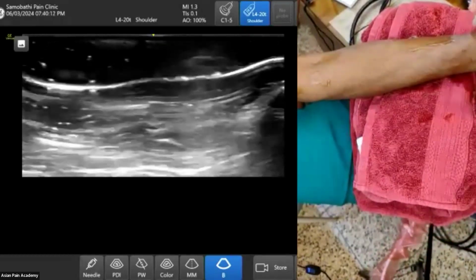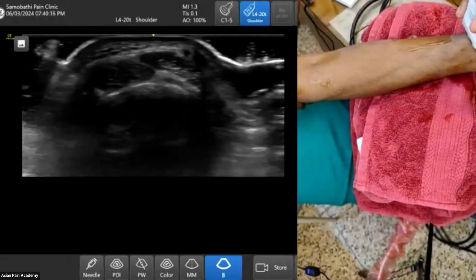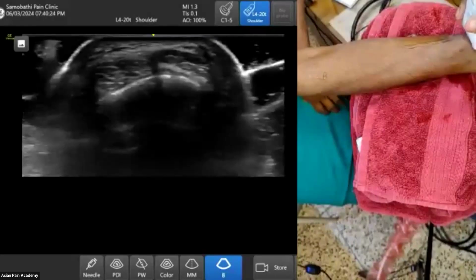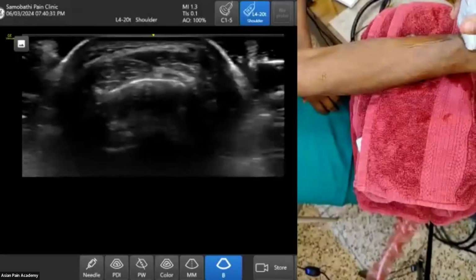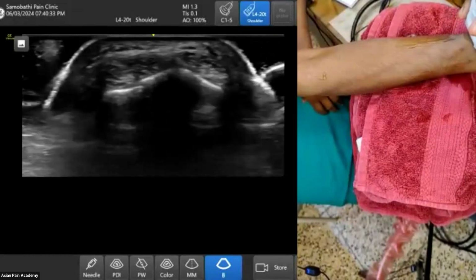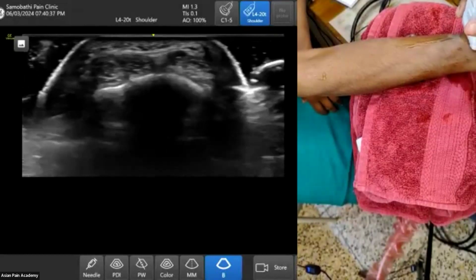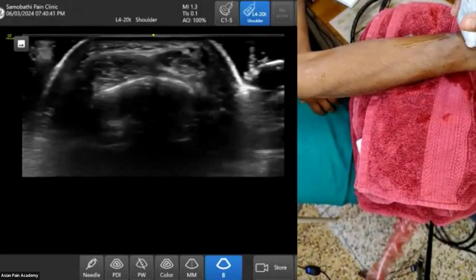I think the dorsal compartment is covered or not? The first compartment is in the syllabus. The second compartment is not in the basic course, but still I have shown them. Can you see one nerve bundle moving from the right side of the screen towards the left side?